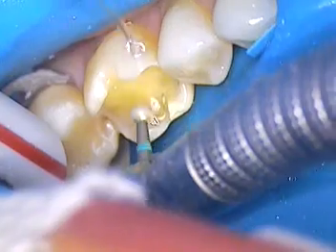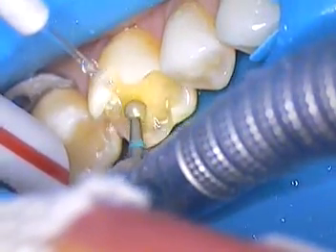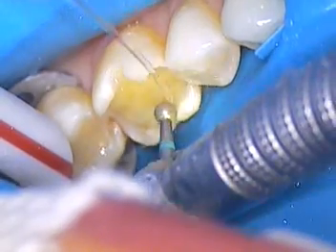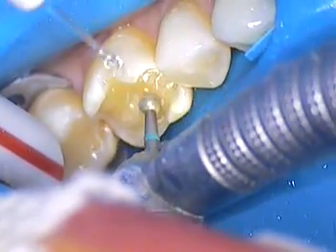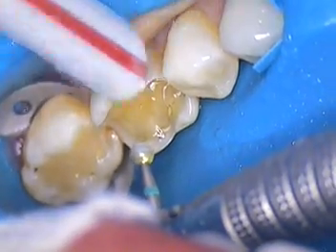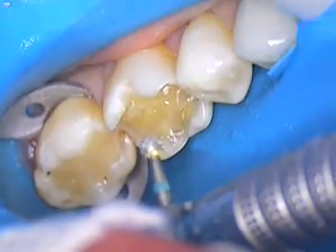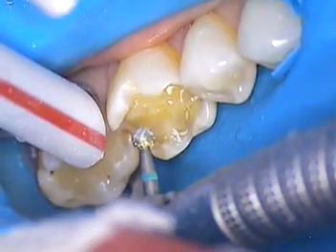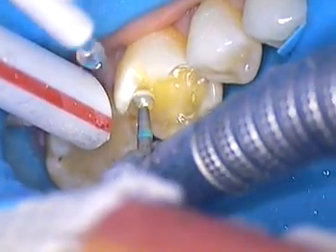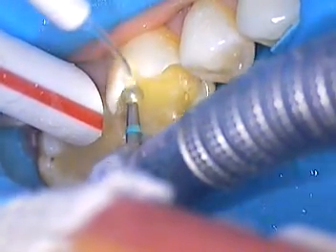It'll be a little bit of a challenge to get all the composite out of there, so we have to use some of our higher power techniques. I didn't check with the patient — I don't know how old these fillings are in her mouth. Maybe you can raise your finger and let us know, Maria. More than 10 years? Yeah — okay, so more than 10 years.